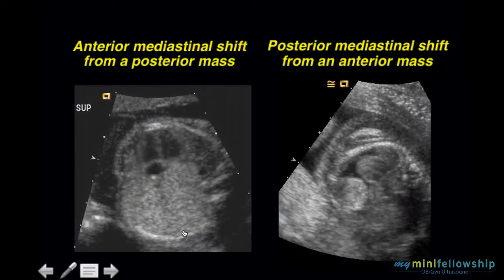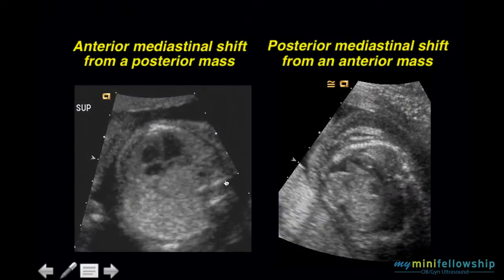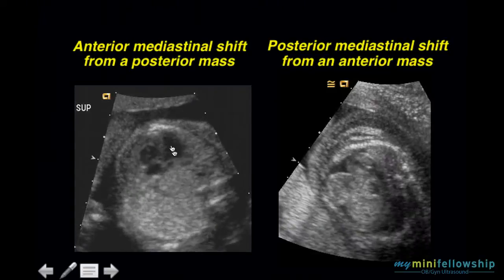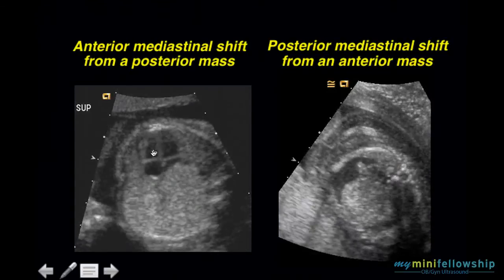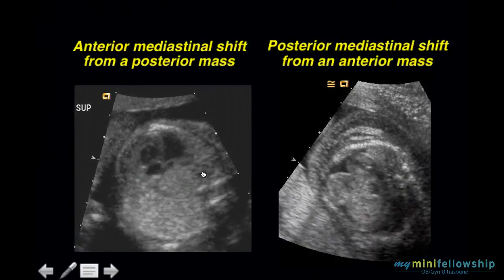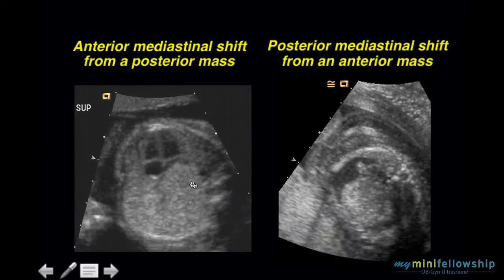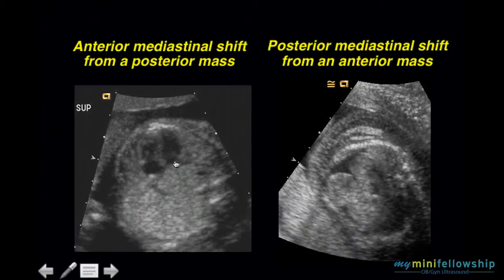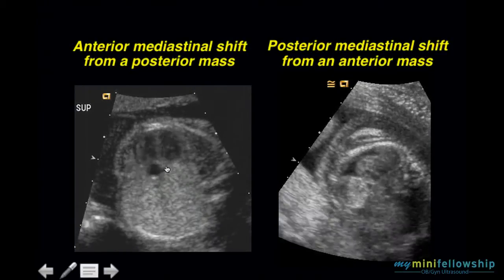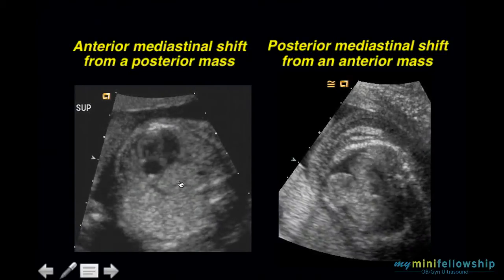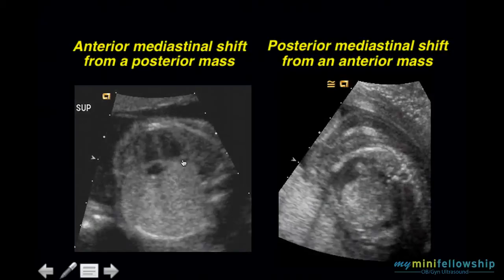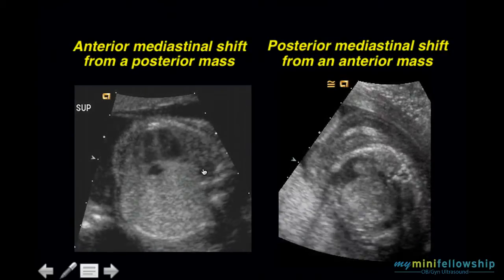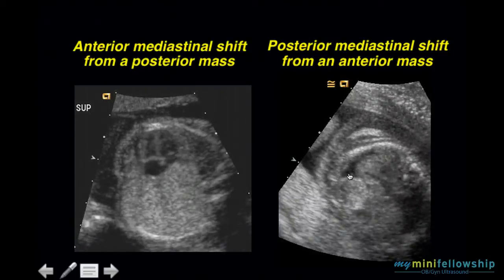Here we have spine, descending aorta, left atrium, left ventricle, right ventricle, right atrium. Quite obviously, there's a gap between the aorta and the left atrium because of the presence of this rather formidable mass.